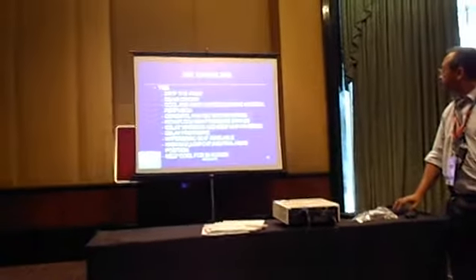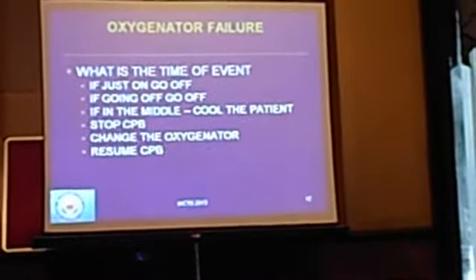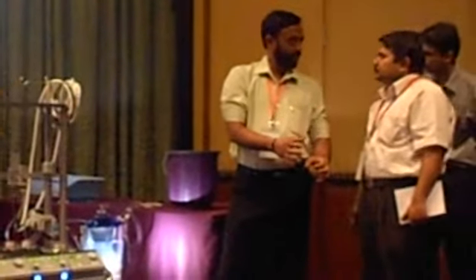I have to do it. So I take a separate membrane when we are on bypass. Now once we are set to replace the membrane, he'll give me time. So before that, what I do is I prime the membrane. Everything gets ready.